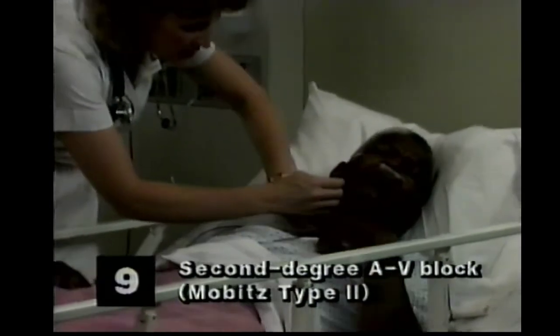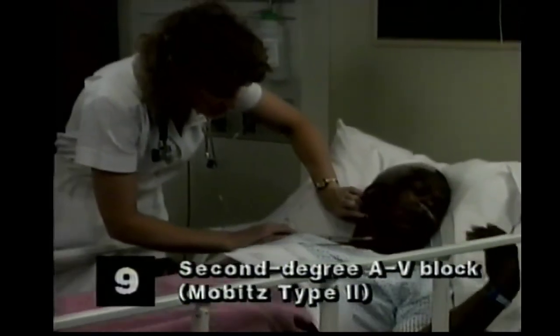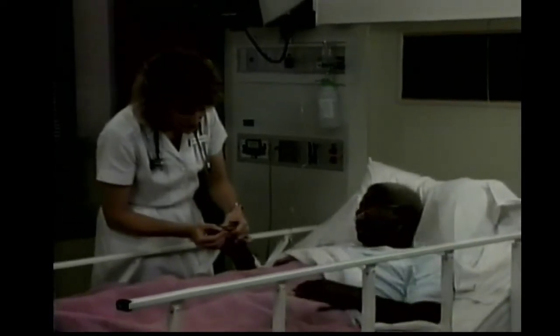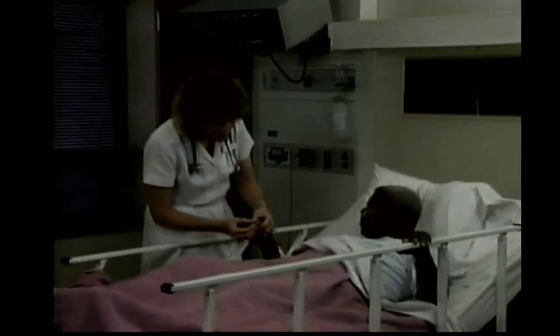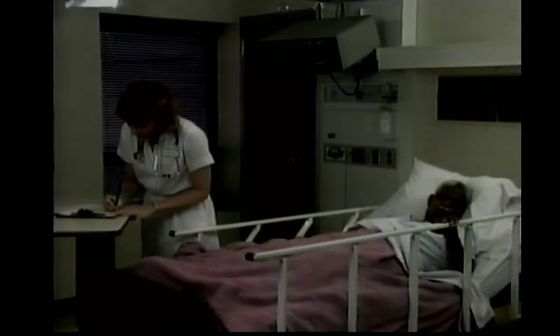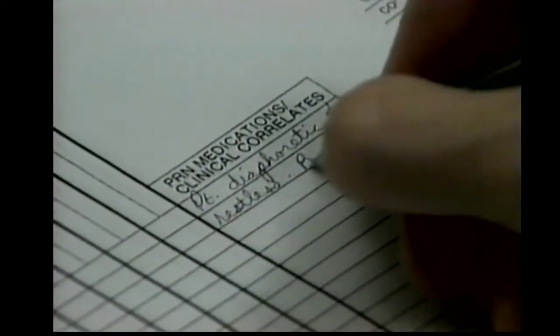This 76-year-old man has chronic congestive heart failure. He was admitted 3 days ago with acute pulmonary edema. He was started on digitalis to improve cardiac output. The nurse notes that the patient is restless and somewhat diaphoretic. His blood pressure has dropped and his urine output has decreased. His heart rate is down to 54 beats per minute.